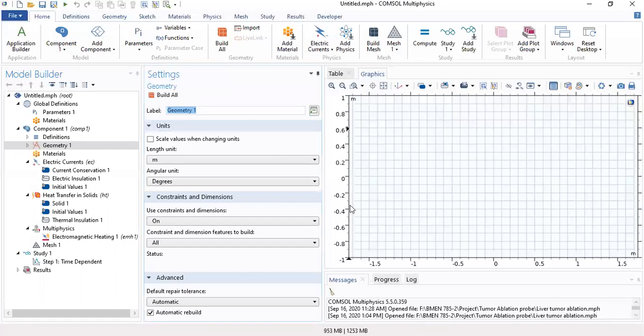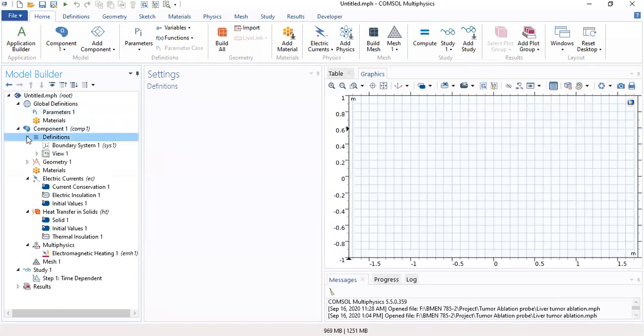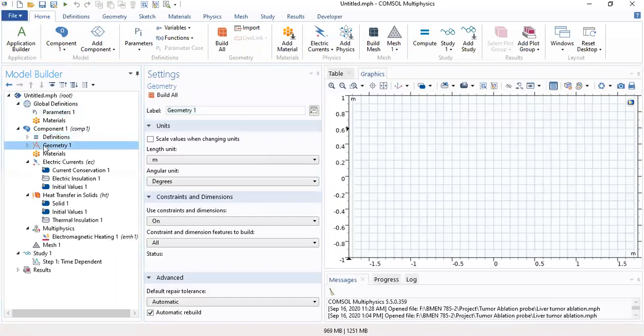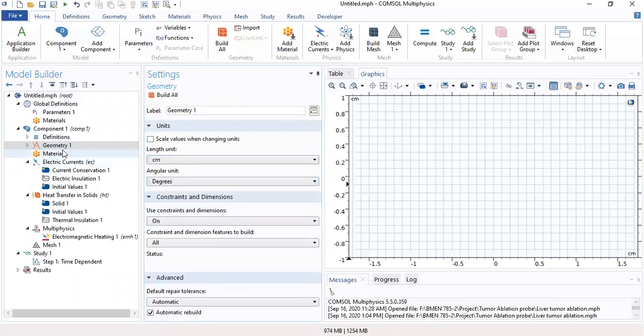So this is your interface for everything that you're gonna do in COMSOL. You have your model builder over here. You have global definitions. We're not gonna use any parameters or anything, but you can assign values to variables here and use those throughout the model. There's your geometry, which is what we're going to start with, and change that to centimeters real quick. You have your materials, your physics, and then your multi-physics, your mesh, your study, and your results.